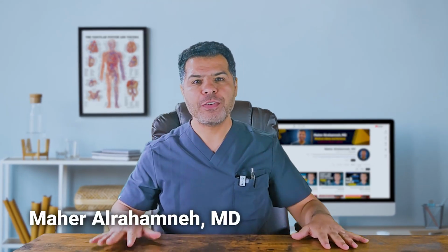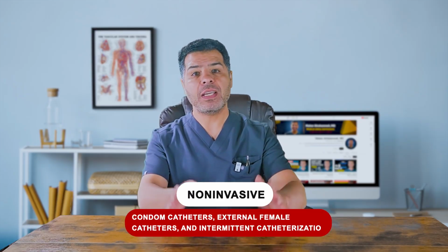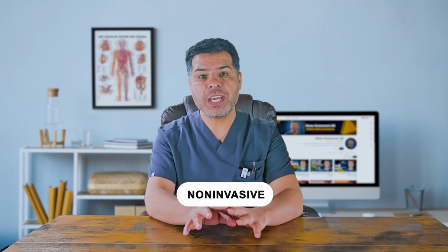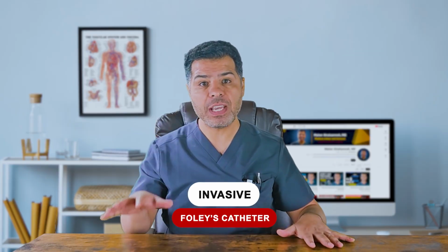Today, I will share 5 important things we must know about Foley catheters before starting inpatient rotations. Let's get started. Urinary catheters are categorized into non-invasive like condom catheters, external female catheters, and intermittent catheterization. Yes, intermittent catheterization is considered non-invasive. And of course, invasive urinary catheters, i.e. Foley catheters. Foley catheter is an invasive urinary catheter.